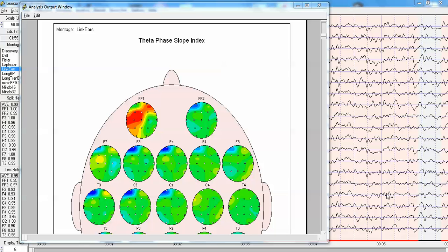It's really based upon the imaginary part of coherency in which when there's volume conduction, there will be no net information flow. And in fact, here's a picture from NeuroGuide that I will be showing other examples of.